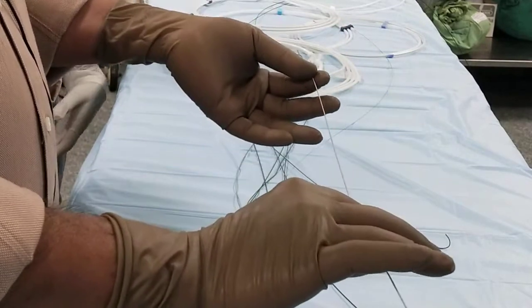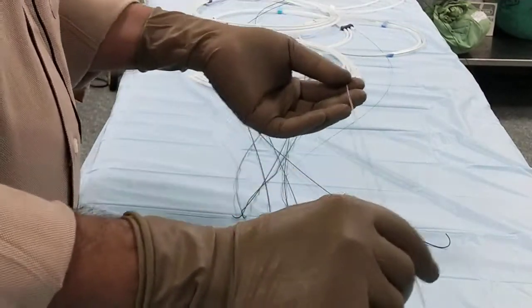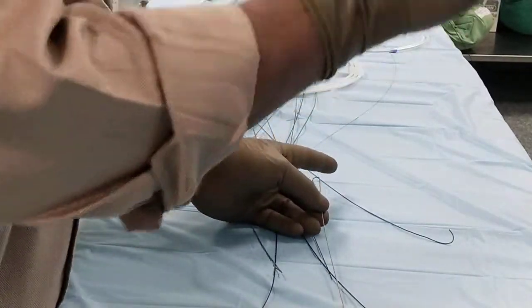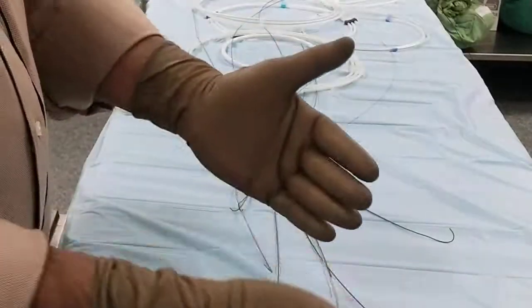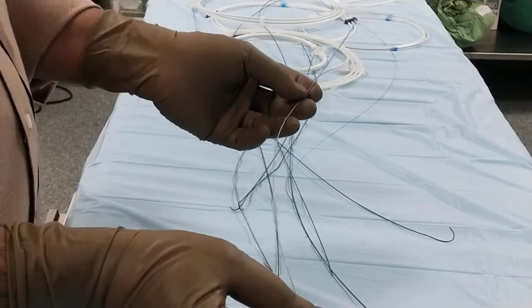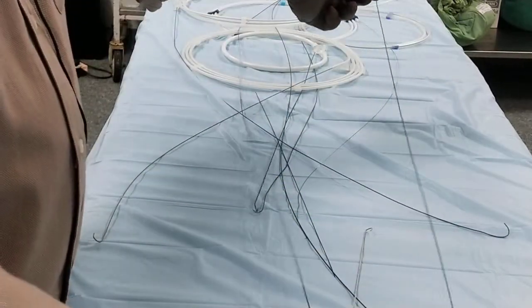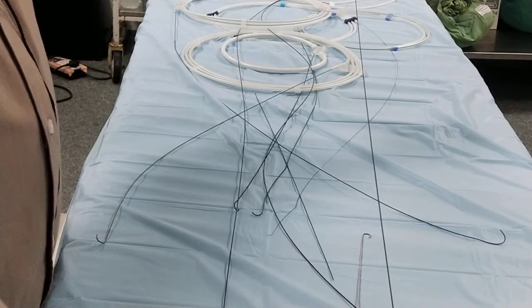When puncturing the femoral artery, you need a 0.038 guide wire. Sometimes the femoral artery is a little tortuous and not smooth — the structure inside the body differs from patient to patient. If the patient has atherosclerotic disease, then negotiation of the wire is very important. In that case, you may need a hydrophilic guide wire of a longer length, which can be docked in the abdominal aorta.